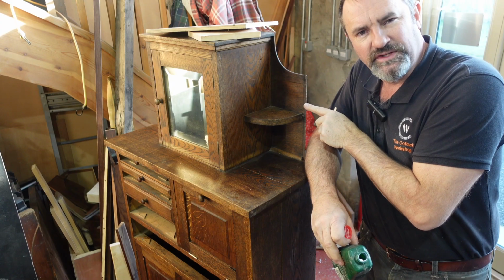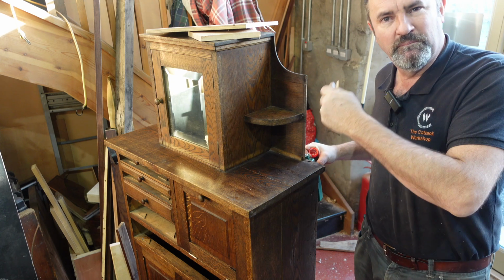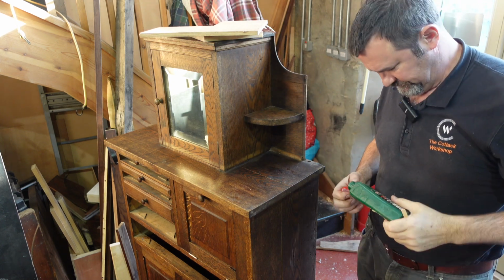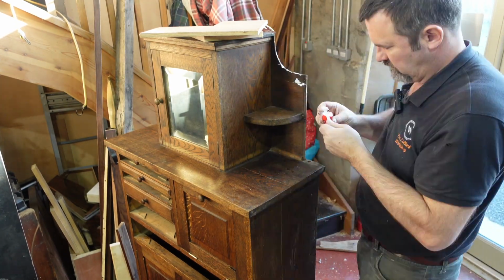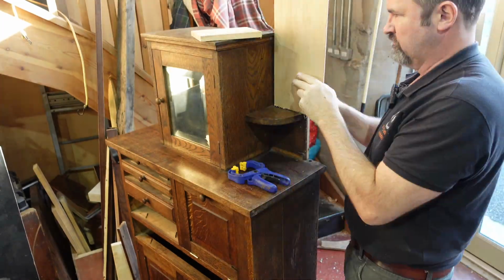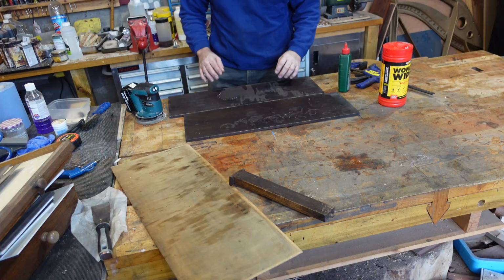So this veneer is coming off here, and what I'm going to do is just put some regular wood glue onto the back edge, blow some compressed air in to try and spread it around, and then take some pieces of wood, clamp it up. So that's all clamped up, we'll leave that to dry.